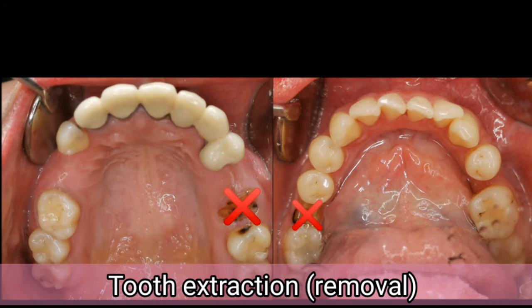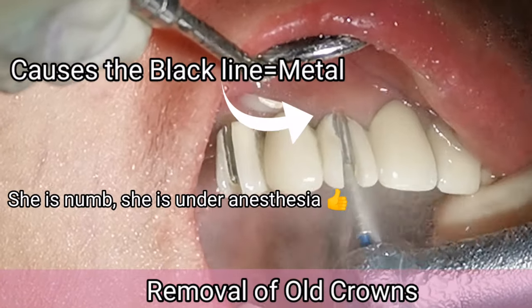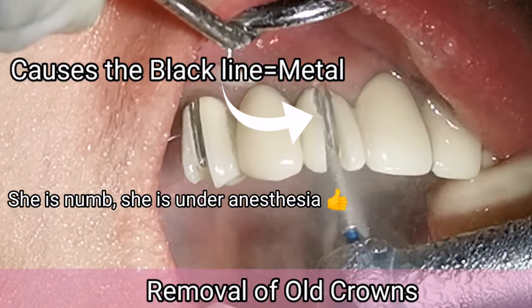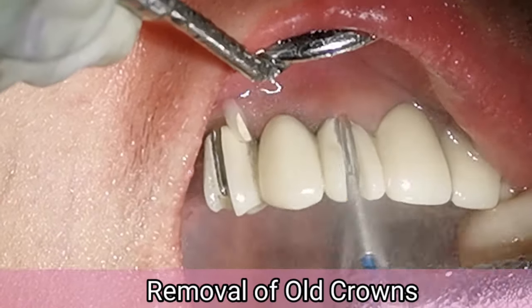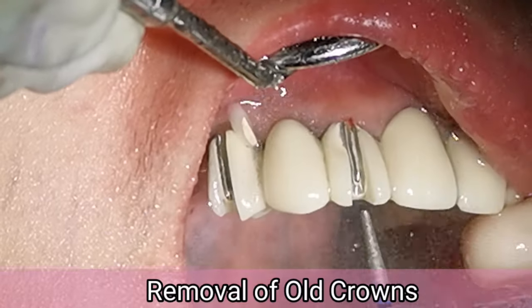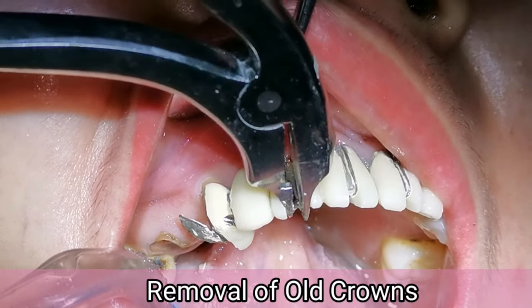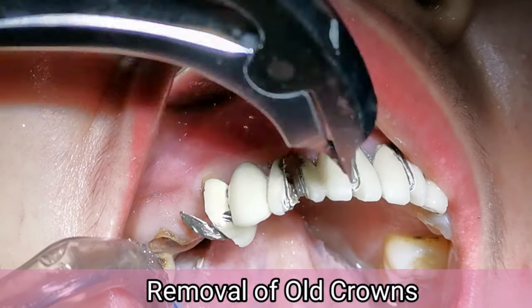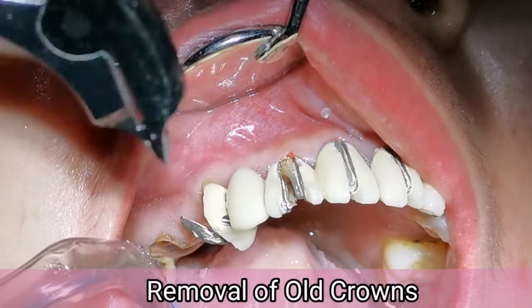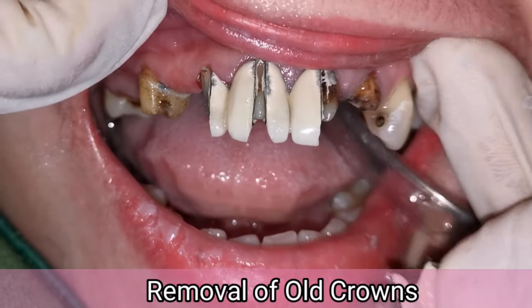Then I extracted two teeth to give room for the new crowns. The black lines showing at the gum margins of her crowns were metal underneath the porcelain. To prevent this problem in the future, I suggest choosing a crown without metal. To remove all the dental crowns, which are permanently cemented, I had to cut and section through the porcelain and metal, then placed an instrument between the pieces to separate and loosen them.